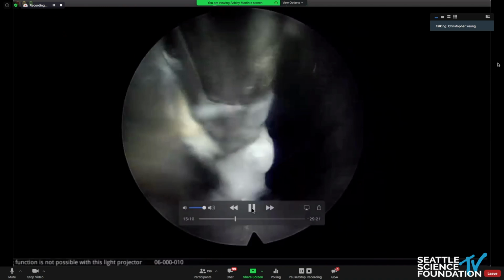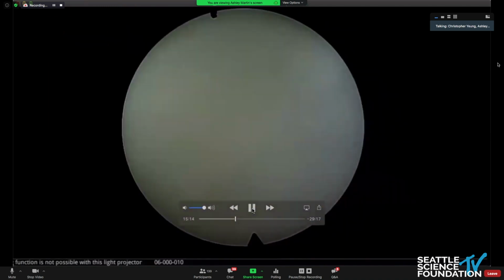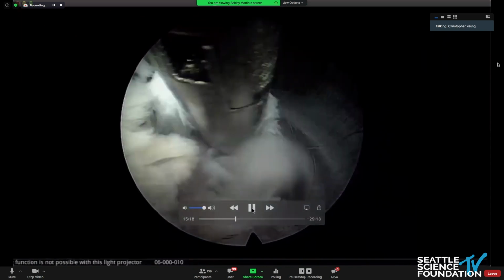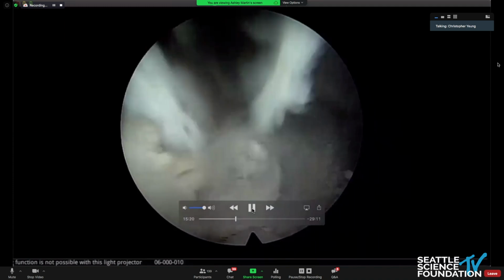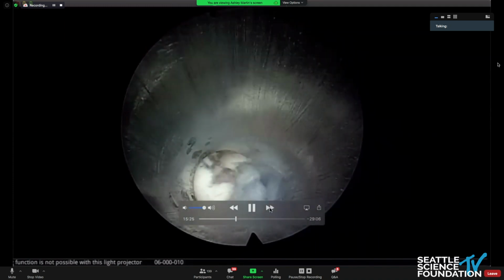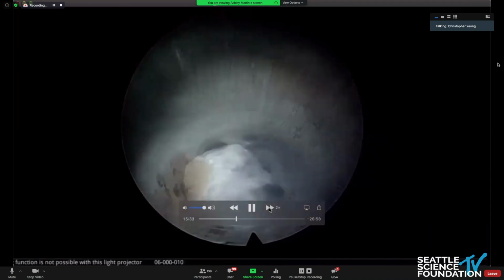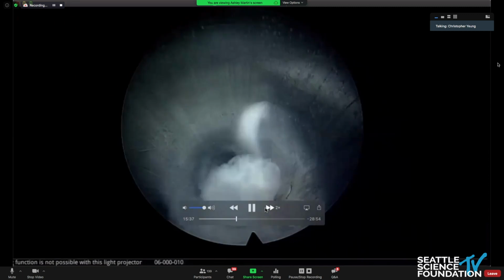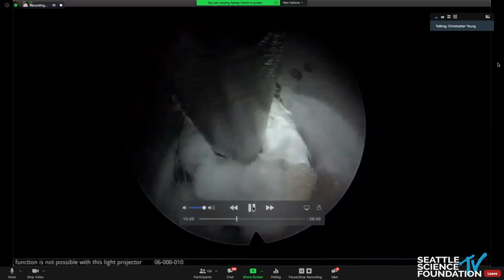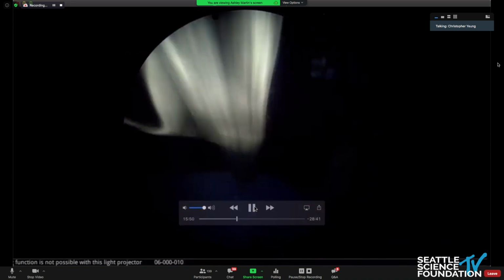There, so now you can see the annulotomy in there, and right now I'm just picking out a lot of the loose unstable disc right in the foramen with the probe. I'm going to fast forward this now. Basically, we'll just be turning the cannula around there and looking around the foramen, trying to get more disc out. And so here's some more disc right there in the foramen.